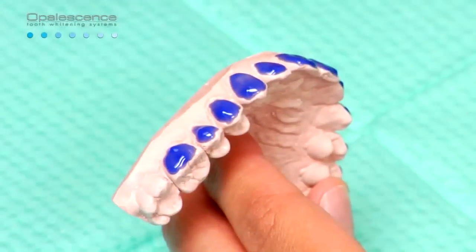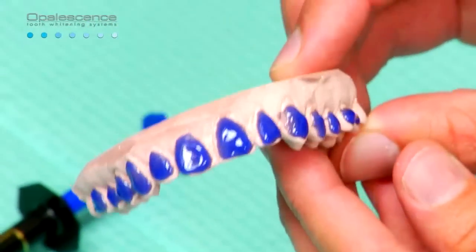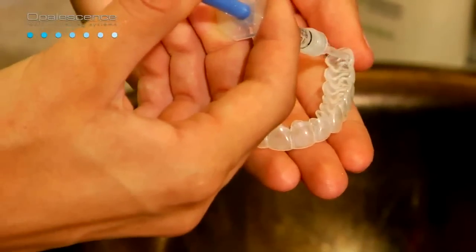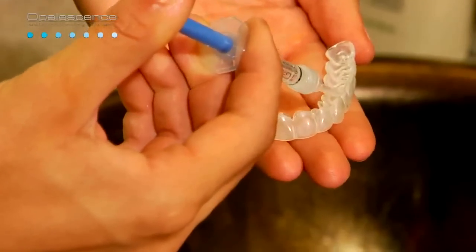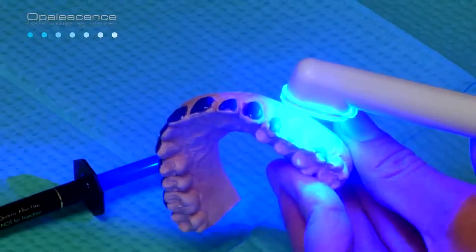Stay about 1.5 millimeters from the gingival line. Do not extend to the incisal edges and the occlusal surfaces. This prevents the margin of the tray from opening upon biting and or impinging on soft tissues. Patients may experience less tooth discomfort from tray pressures with reservoirs because of reduced orthodontic pressures. In addition, studies have shown that without custom reservoirs, there may be a greater likelihood of physical loss of bleaching agents.